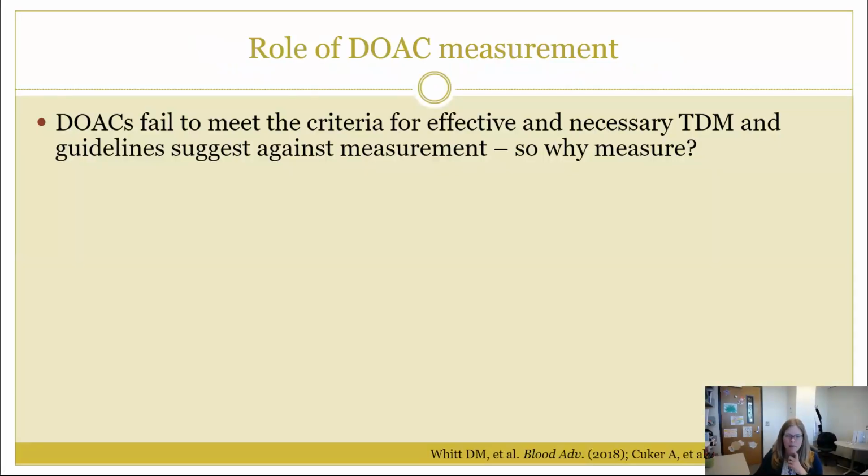So, do DOACs meet any of these criteria that would necessitate effective and necessary therapeutic drug monitoring? They don't really, and actually that's the main reason why most guidelines suggest against measurement and monitoring. So why are we even talking about this?